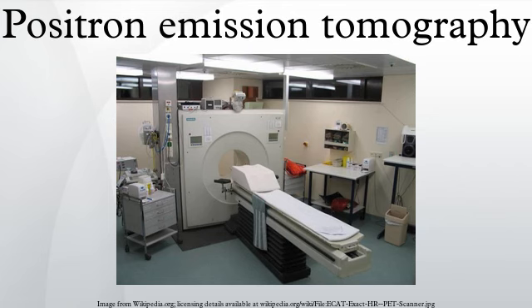The compound was first administered to two normal human volunteers by Abass Alavi in August 1976 at the University of Pennsylvania. Brain images obtained with an ordinary nuclear scanner demonstrated the concentration of FDG in that organ. Later, the substance was used in dedicated positron tomographic scanners, to yield the modern procedure.